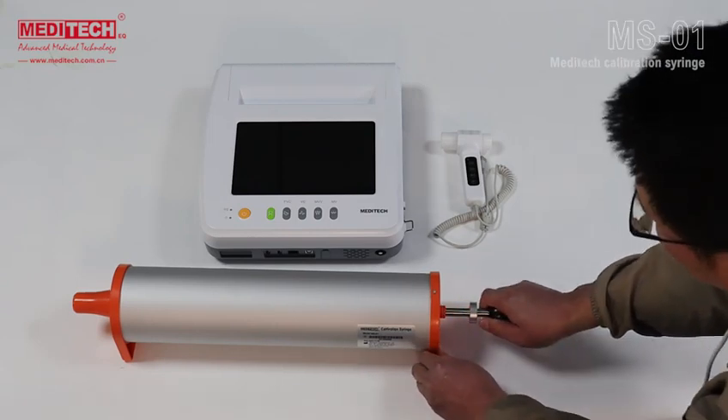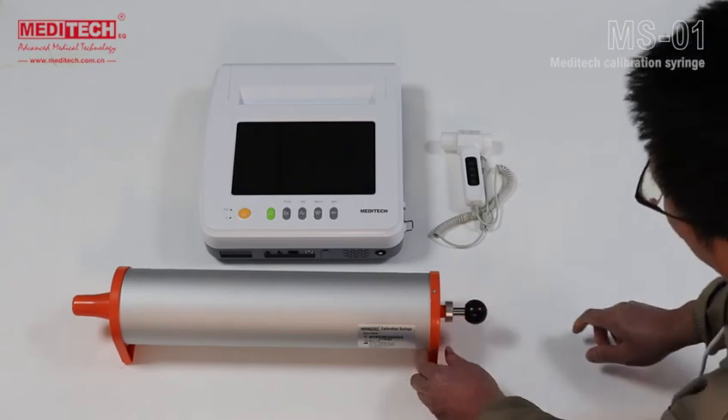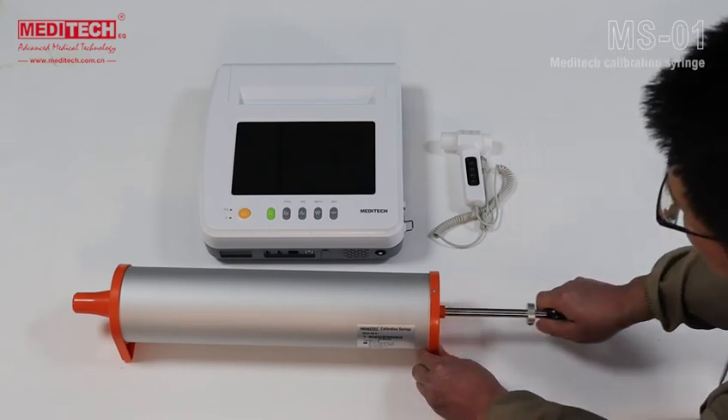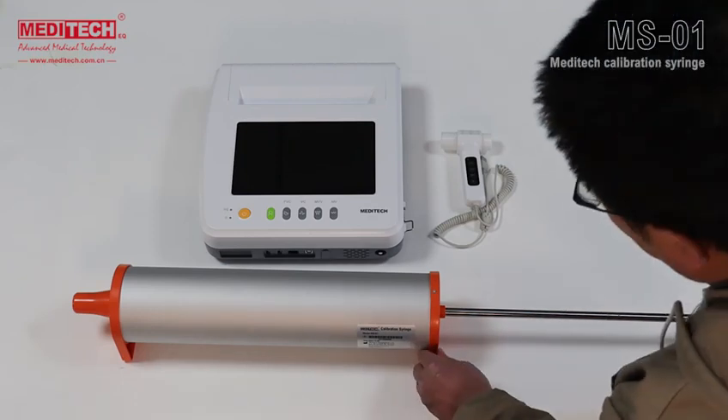The second cycle is at medium speed, about 1 and a half seconds. The last cycle is at high speed, completing the push and pull within 1 second. After completing the last cycle, the handle must be pulled to the maximum position to display the results of the calibration test, then push the handle back to its original position.